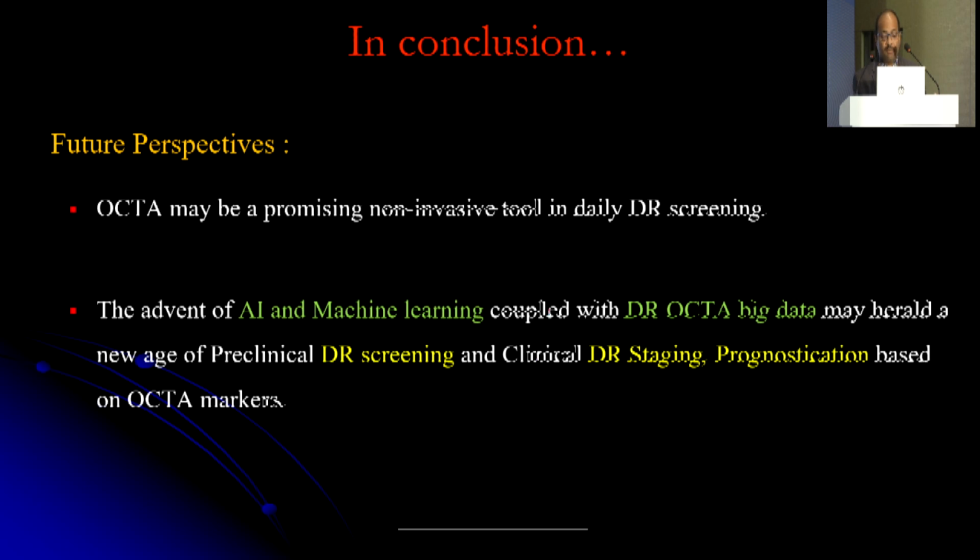Future perspectives: it may be a promising non-invasive tool in daily DR screening, and the advent of AI and machine learning coupled with DR OCTA big data may herald a new age of preclinical diabetic retinopathy screening, clinical DR staging, and prognostication based on OCTA markers.